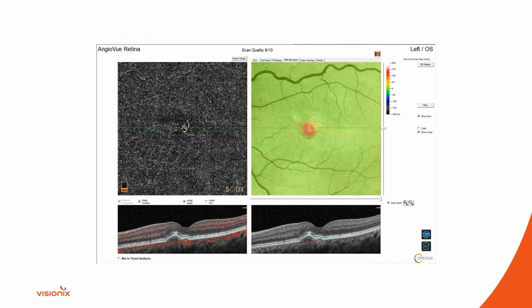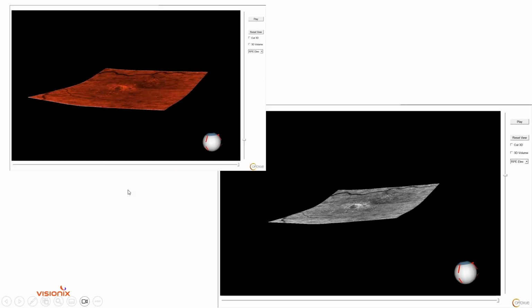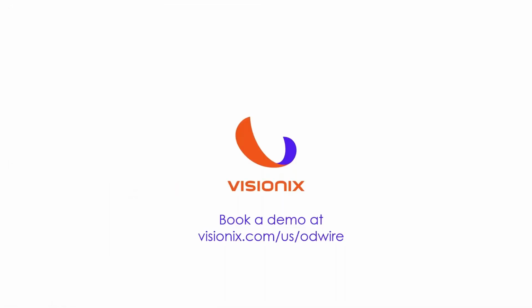Here's another example, just to show you this little nugget. This was the bleed right there. And here's my little choroidal neovascular membrane. I was just showing you different slices, different angiograms. I'm going higher up into the retina here. I'm at the level of the yellow. And this is just another example. I was playing around with it.